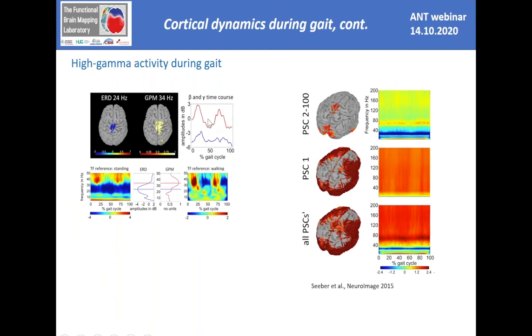If you don't correct for artifacts and you look at high gamma activity in source space, you have this widespread lateral huge activity indicated in red, right? But then we know the spectral profile of the EMG, or electromuscular activity, primarily produced by the face or neck muscles. They have a very strong activity that is spread over all frequencies, right? So that's very stereotypical for muscle activity.